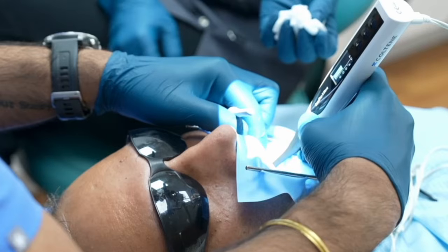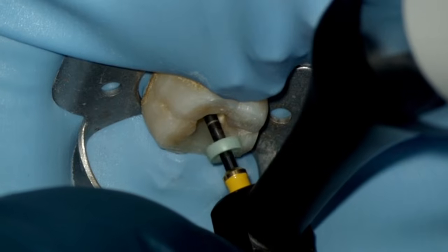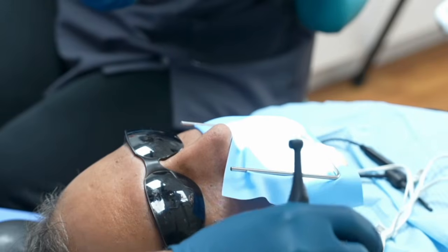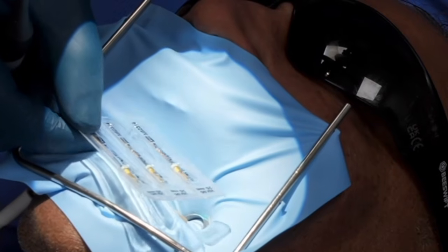Having got the shaper down there, if you're following the OGSF sequence, you would have finished on a 30.04, but as I mentioned before, anatomy should guide the preparation. Because the roots were so thin and narrow, I didn't want to over prepare the canals. HiFlex EDM also has, as well as the OGSF sequence, other files. So the preparation file is a 20.05 finish, and I decided that would be appropriate in this case. Having used the shaper, we used the preparation file and then thoroughly cleaned and disinfected the canal systems, and I was happy with our shaping process.